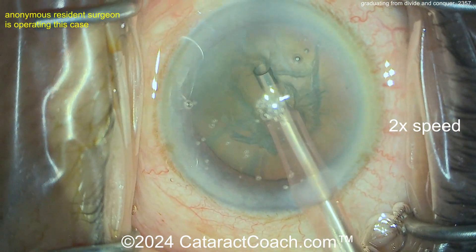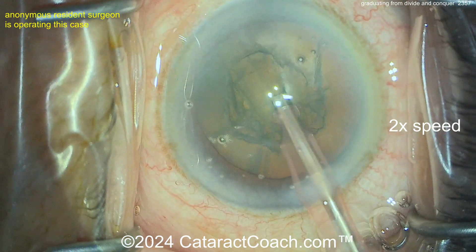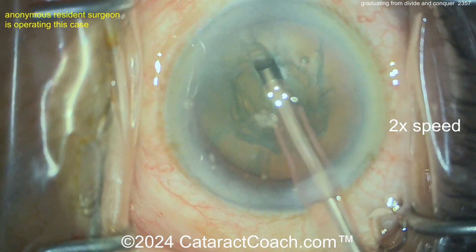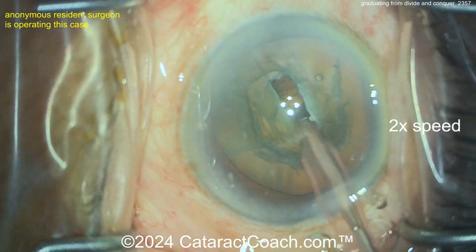Here we go — going in now with bevel up, doing some cleaning of the anterior cortical material. Then here comes the groove down the middle. Look at that — beautiful job making the groove. You're keeping the eye pretty much in primary position. I like that. I'd widen up the groove a little bit here.